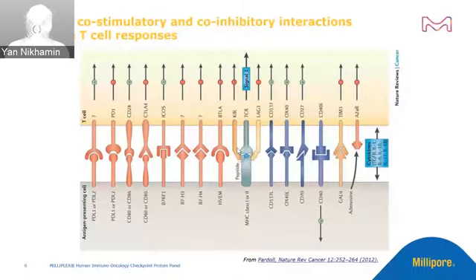And we know that there are cytokines that are soluble molecules flowing in the system that interact with all the cells to have these interactions happen. However, in the cancer or tumor environment, whether in the body or in the microenvironment itself, a lot of these checkpoint or inhibitor molecules can be cleaved. And if they are cleaved, we now have the opportunity to measure their presence and perhaps get a little bit more insight into the disease state.